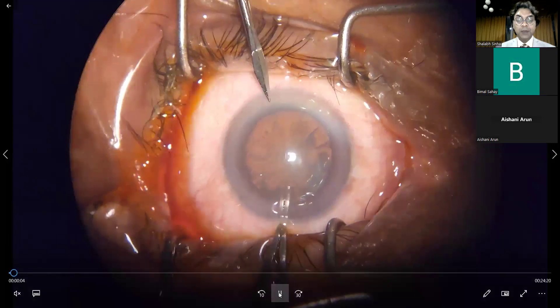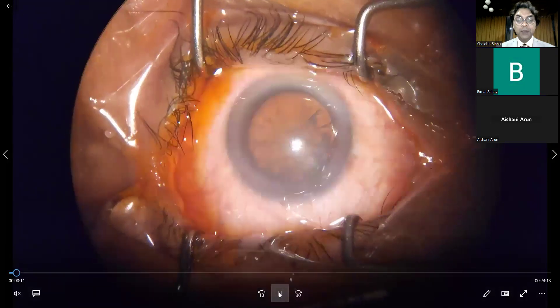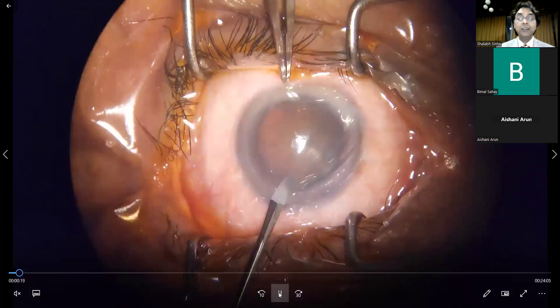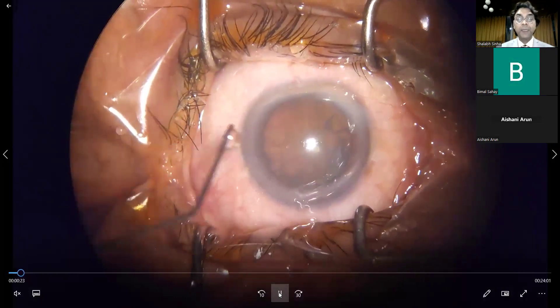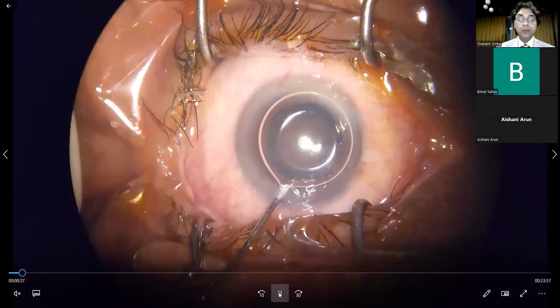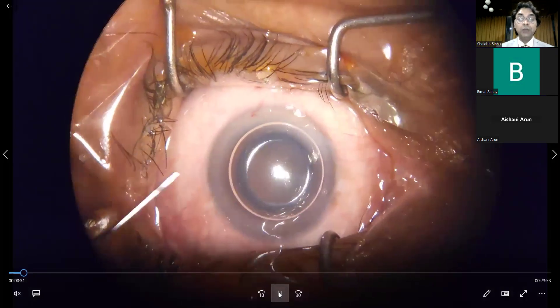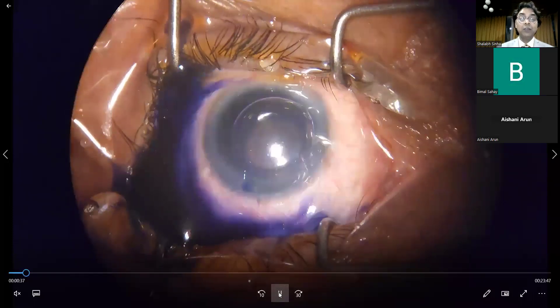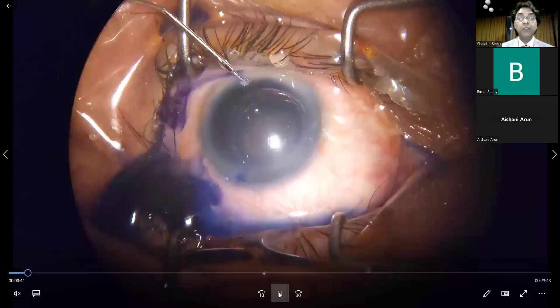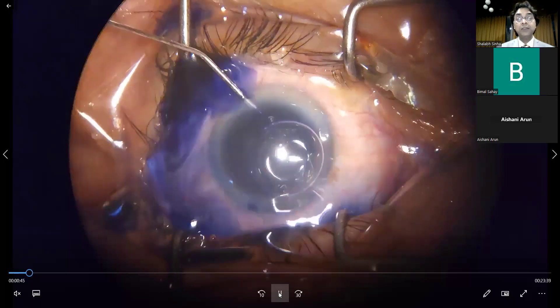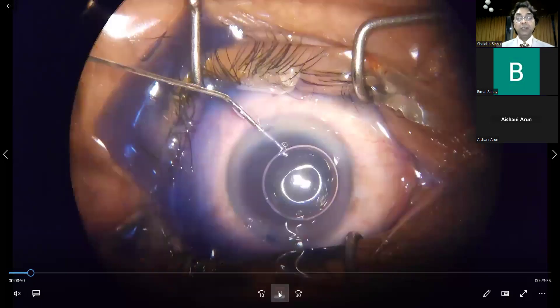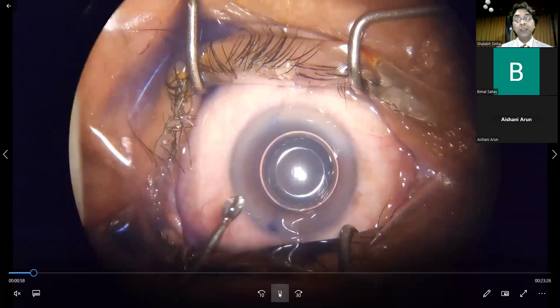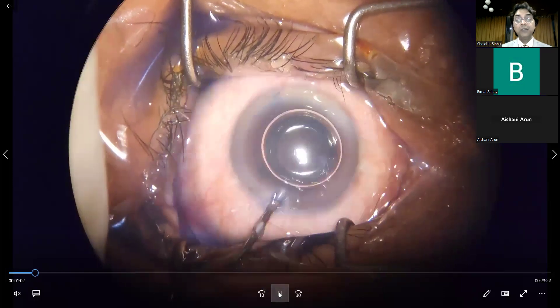This is a patient who had about grade 2 nuclear sclerosis along with posterior subcapsular cataract. Surgery was begun by making two side port incisions using an MVR blade, followed by injection of a bubble of air to protect the corneal endothelium, and staining the anterior capsule under the bubble of air. Trypan blue is injected from one side and pushed from the other side port to stain both side ports, making the side port more visible.